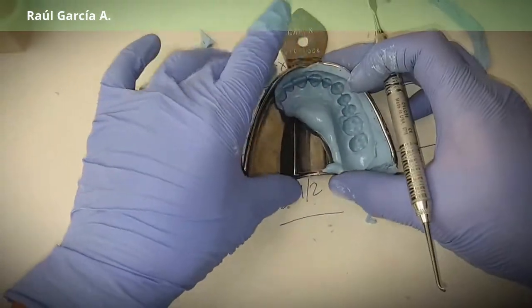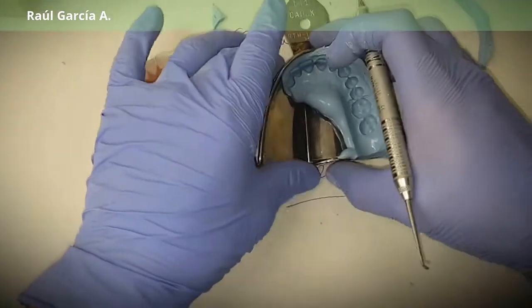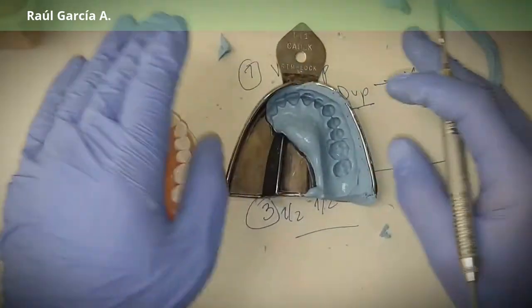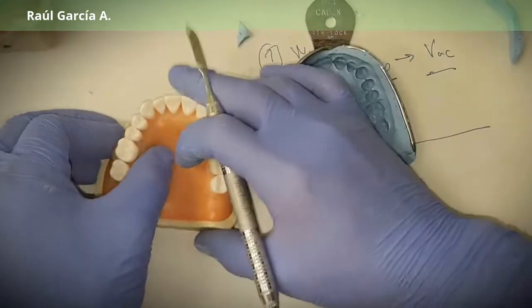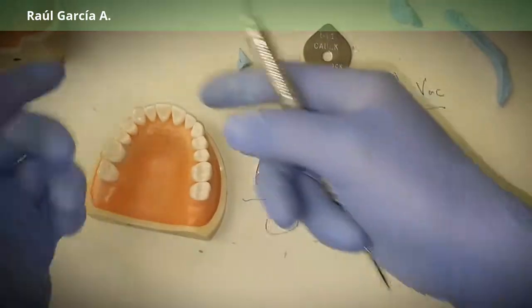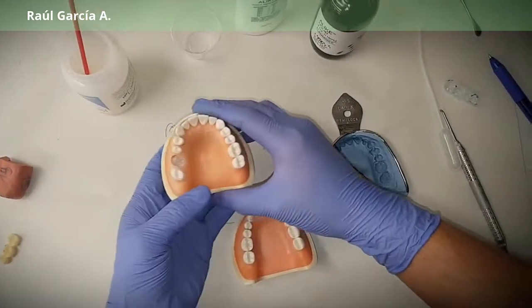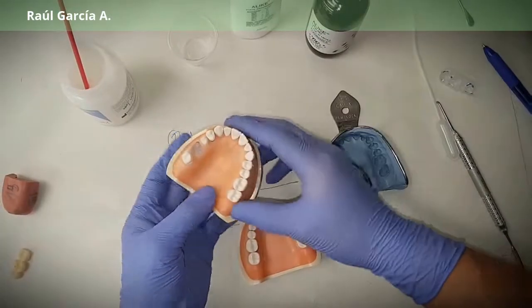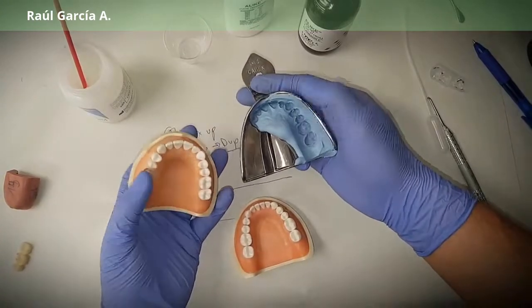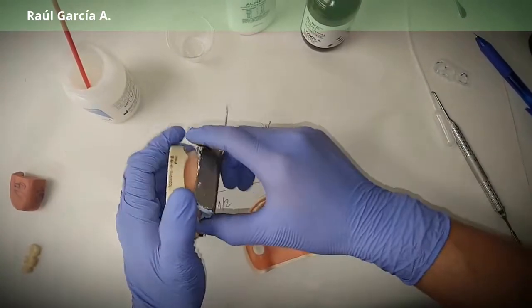You have the impression from the preoperative model. You disinfect it, put it in a plastic bag, and keep it in a wet towel. You have about one hour. Then go to your patient, do your preps — prepare those two teeth. Now, with the teeth prepared, you take your impression and fill it all in with PMMA, then place it back.